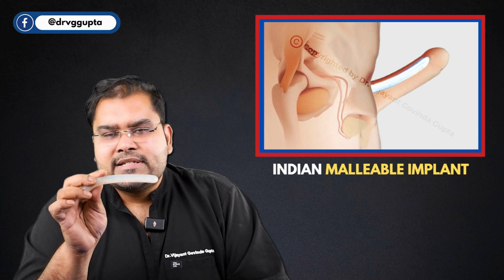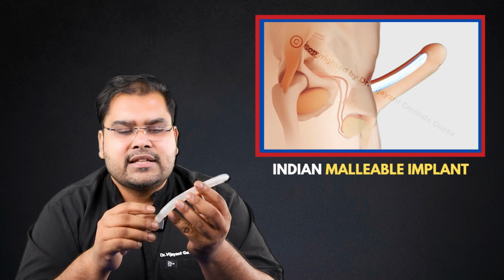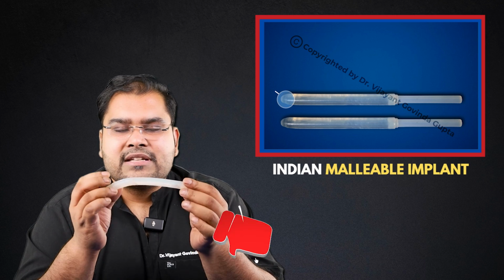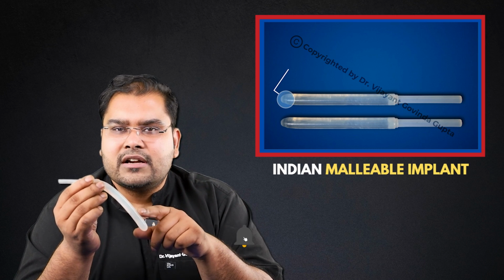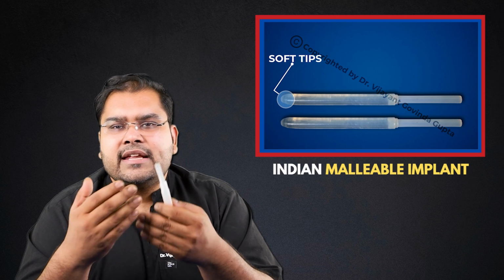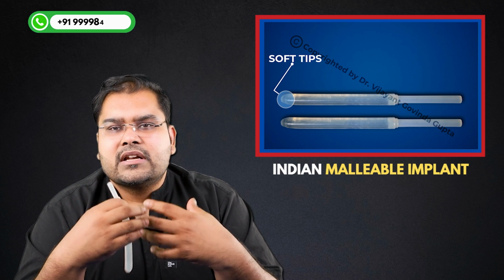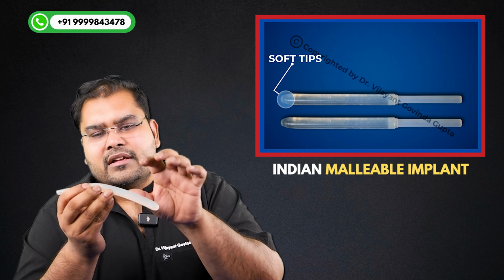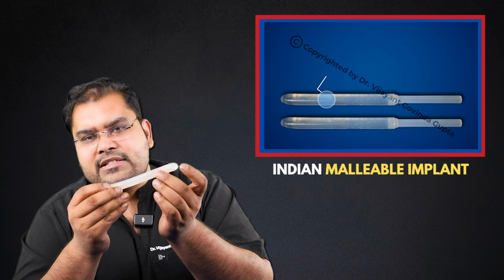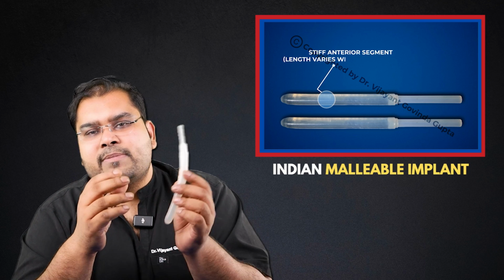So these implants basically work on the principle of support. These implants go inside the penis. They give support to the penis, so they're called semi-rigid. Semi-rigid means normally the penis is not fully hard. The implant is soft. So when somebody is doing his work or is engaged in daily activities, he's not hard, but he's not soft either. But when he's aroused, when the blood gushes in, the blood and the implant together make the penis fully hard, good for sex, and once he discharges, it again becomes soft, and the patient can just pack it off.